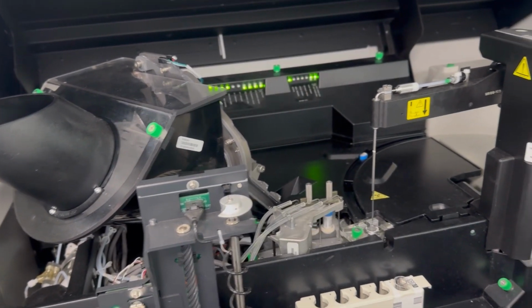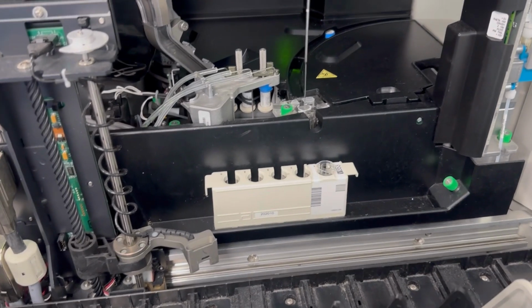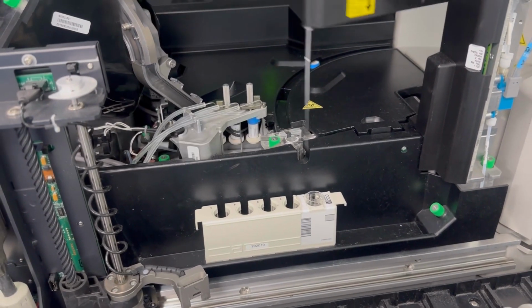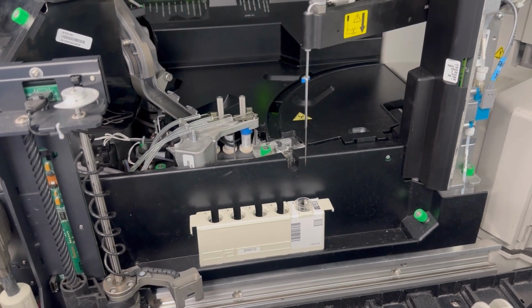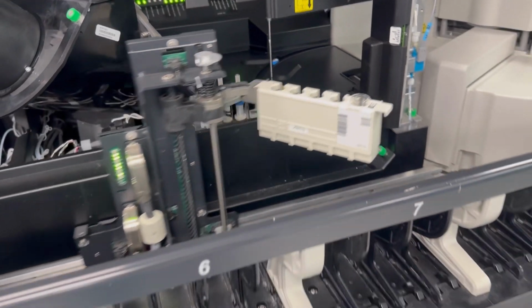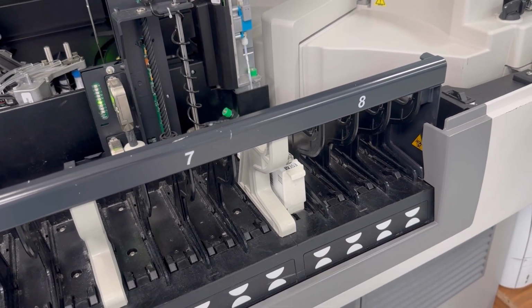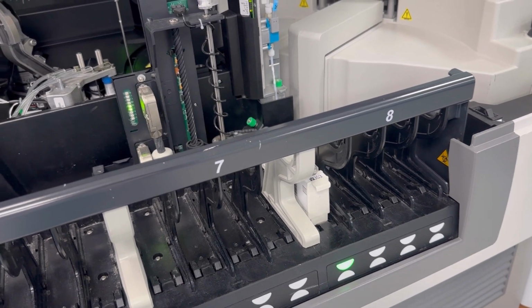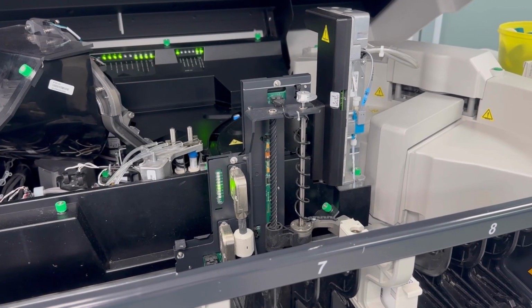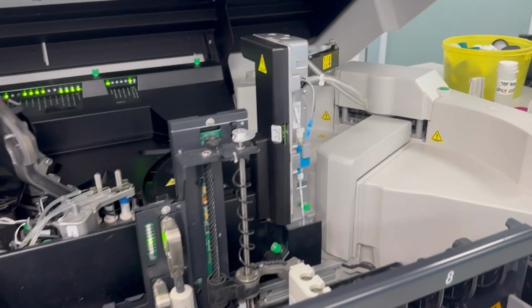Okay, now it will collect the sample from the sample cup. This is how the probe will aspirate the sample. After that, the machine will take back the probe and put it back there. It will give you a green light. Now this indicates that the sample has been processed. Now you can remove the sample from the rack. Okay, this is the hormone part. Just now we discussed the biochemistry part.